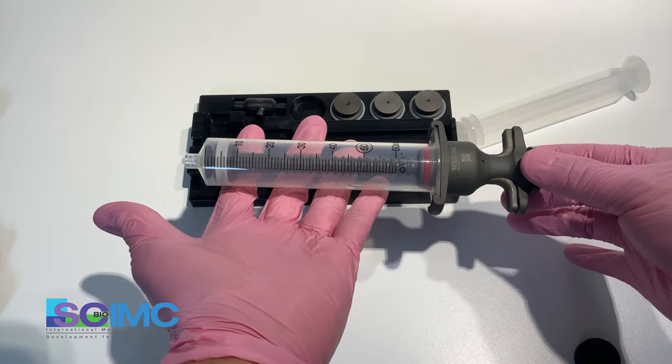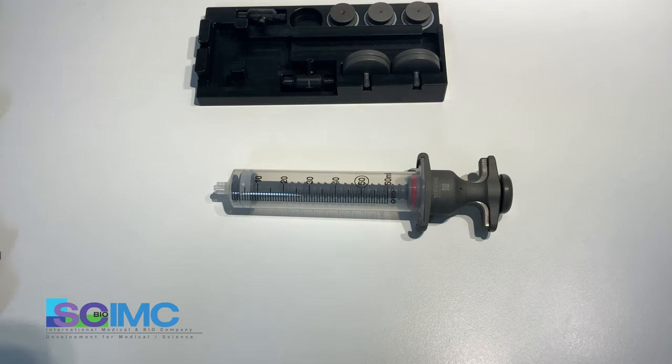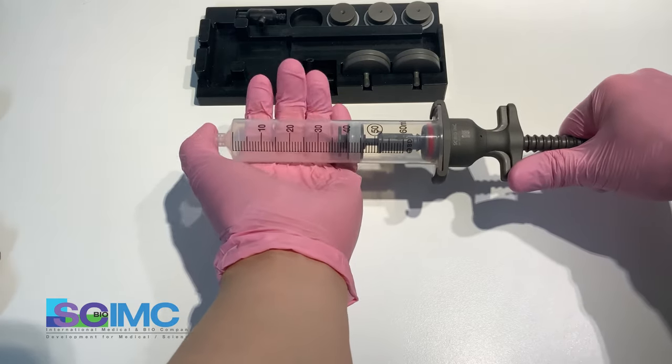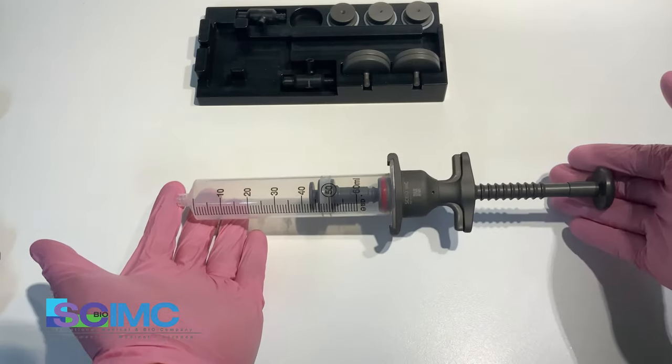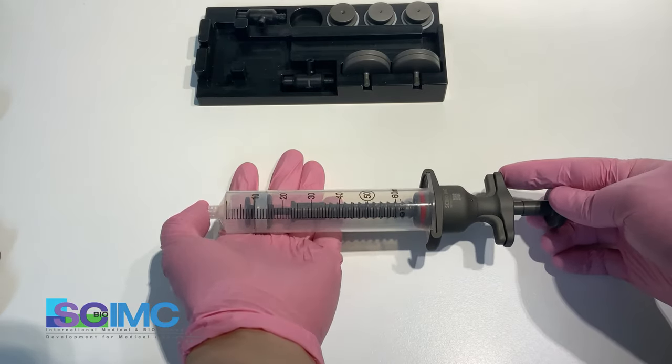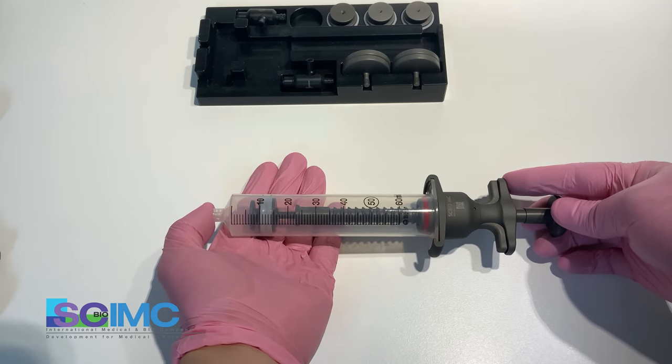Very smooth. This device automatically creates negative pressure when you pull the plunger. Also, you can adjust the negative pressure by removing the plunger three or five clicks.